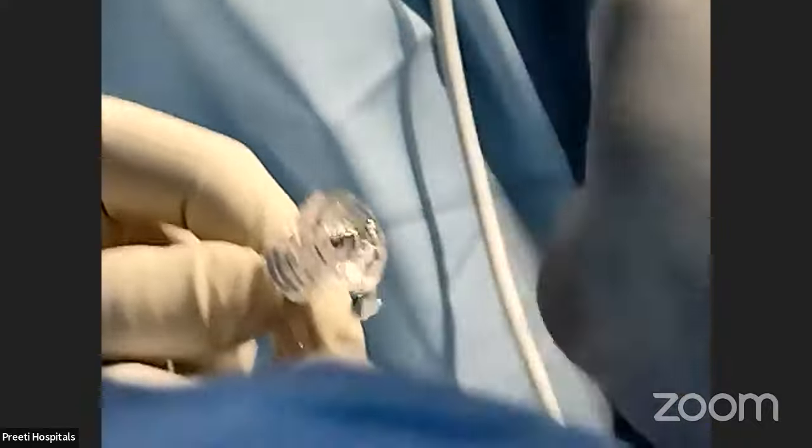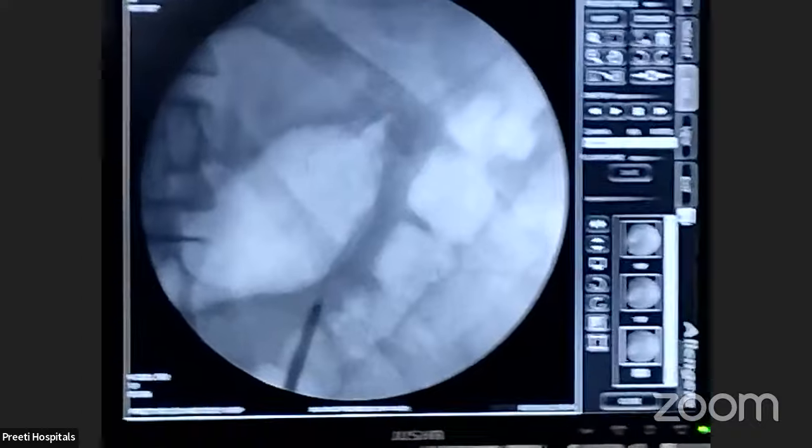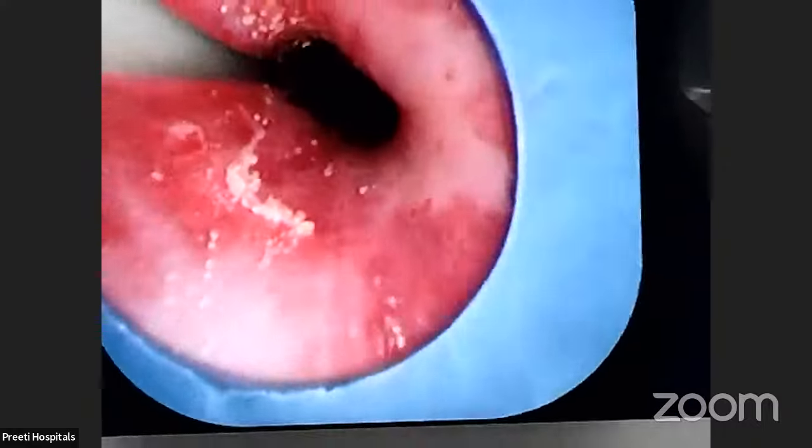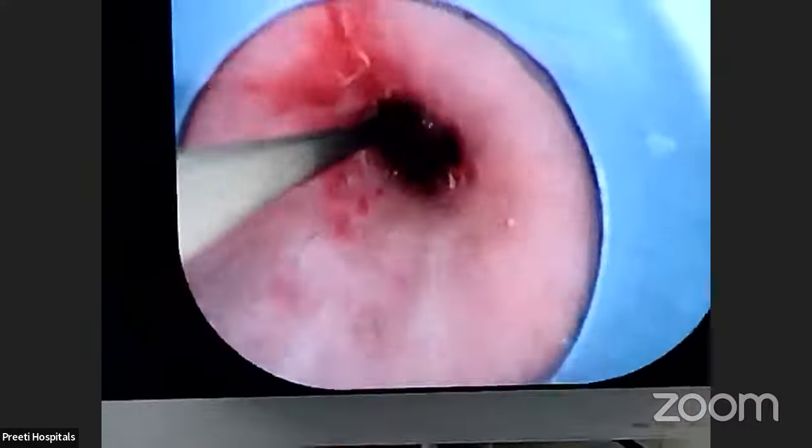So you pass the guide wire, observe carefully what happened to the ureter. Some graze is acceptable. See, the guide wire is there. Now you also come out along with the machine. Somebody push the guide wire. Now this is the sheath. Slowly. See, water flush, please. Water flush. Okay, guide wire too. See. Nothing is there.